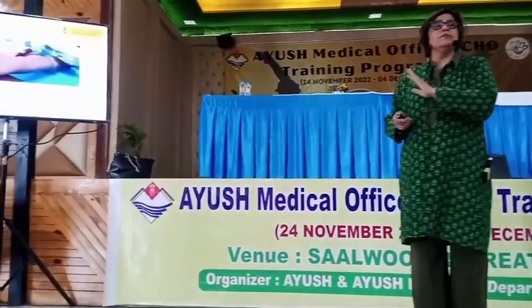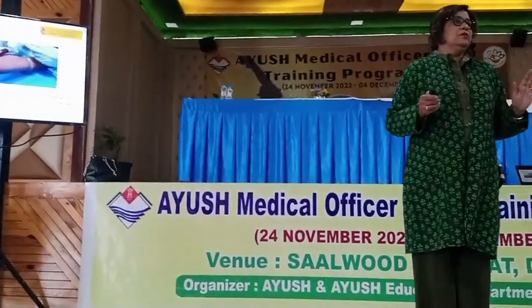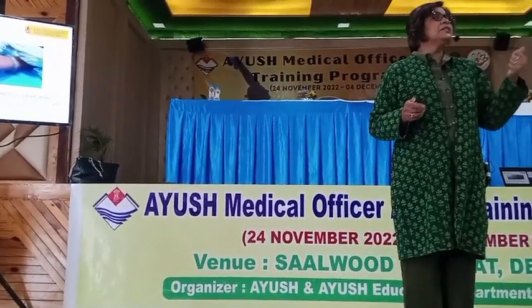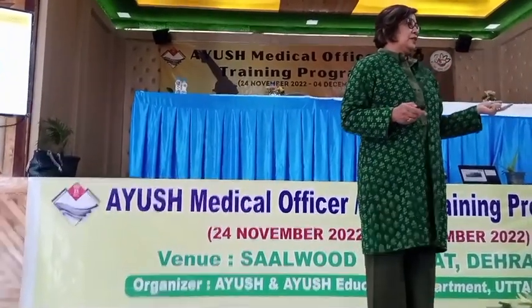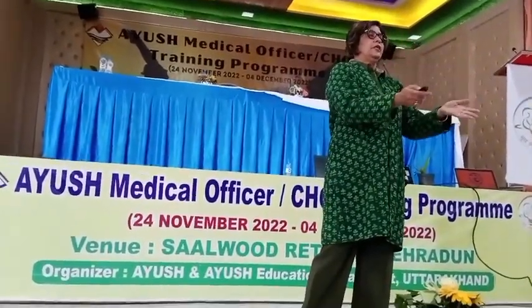This phlebotomy is the most important thing, and any report, let me tell you, we always believe in that. If the sample is collected right, 100%, 200% your report will be right. If there is a problem with the sample, your reports will be affected. So this is a gospel truth in our pathology. आप जैसा sample दोगे, आपको report वैसे मिलेगी.